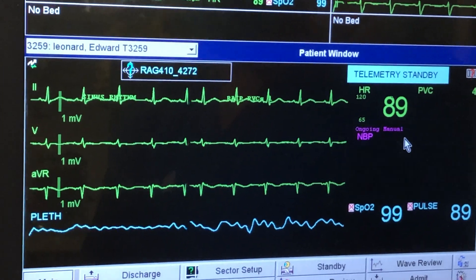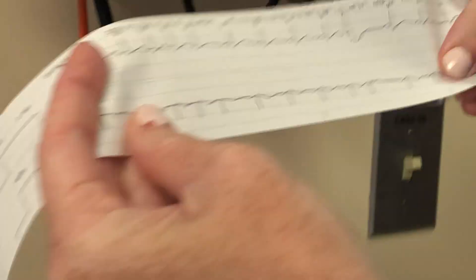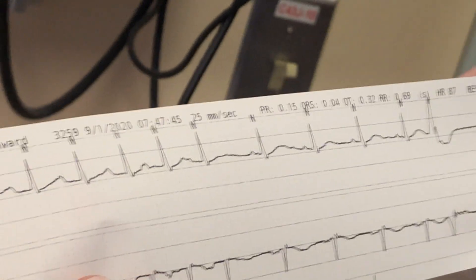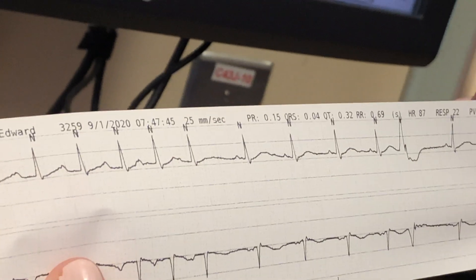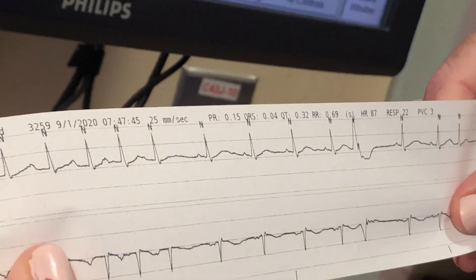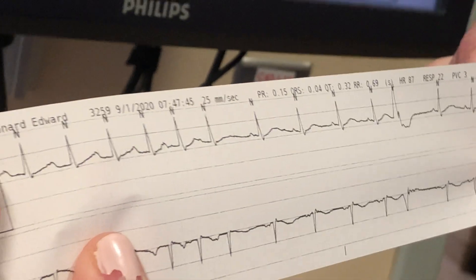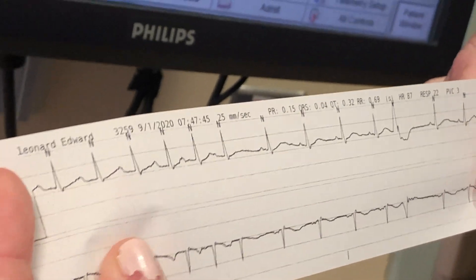For the heart rate, you count the complexes from here. When you use the e-calipers it does print with the PR interval and such at the top, which is nice. I've been telling staff to make note of that, because sometimes we'll see PRs of 0.24 when they might not be picking up a heart block.